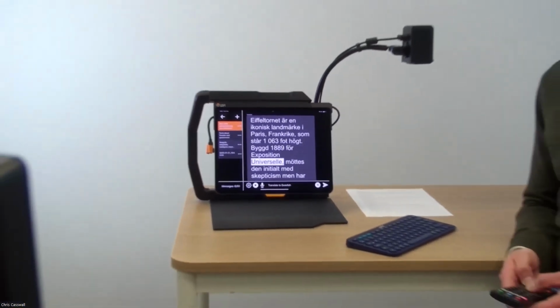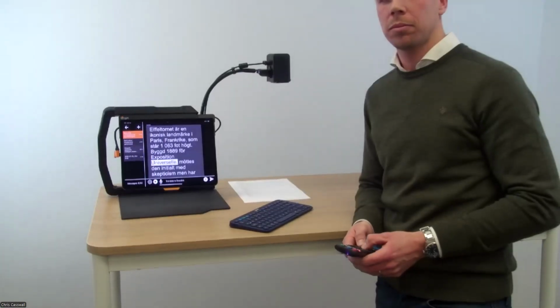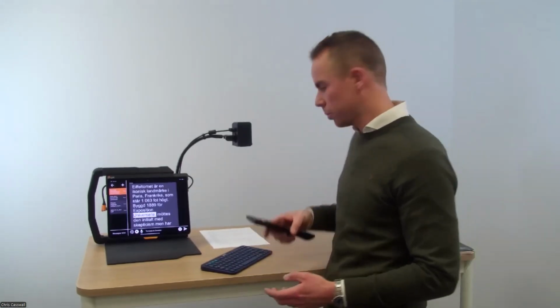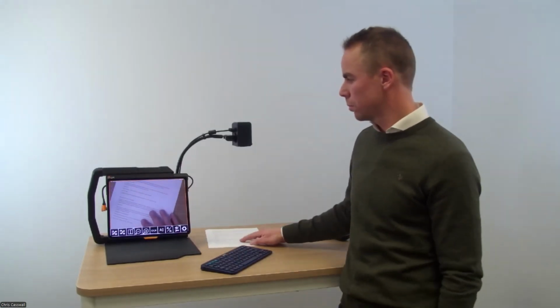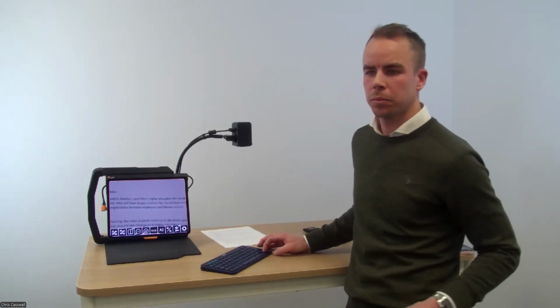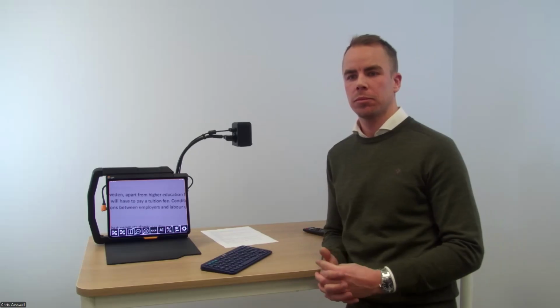And so I'm going to go over the pricing of the major products that we've shown. So the ML Air, the Air Go is $7,995. Again, this is retail pricing US. The MagniLink iTab, whether it's a 12.9 or a 13, it does fit the 13-inch Pro. The retail price is $3,695.